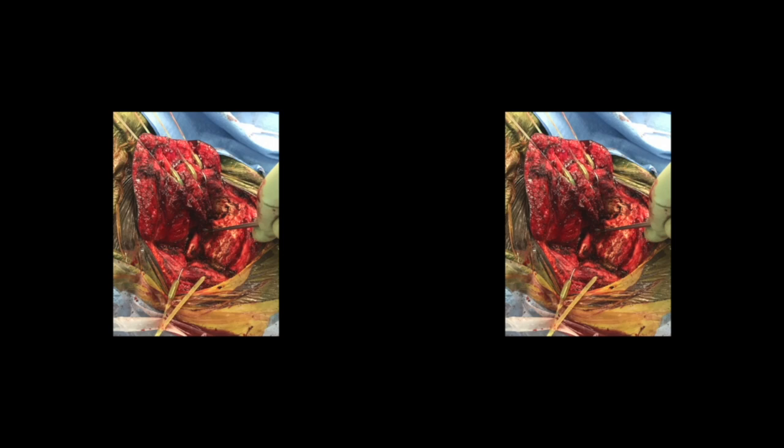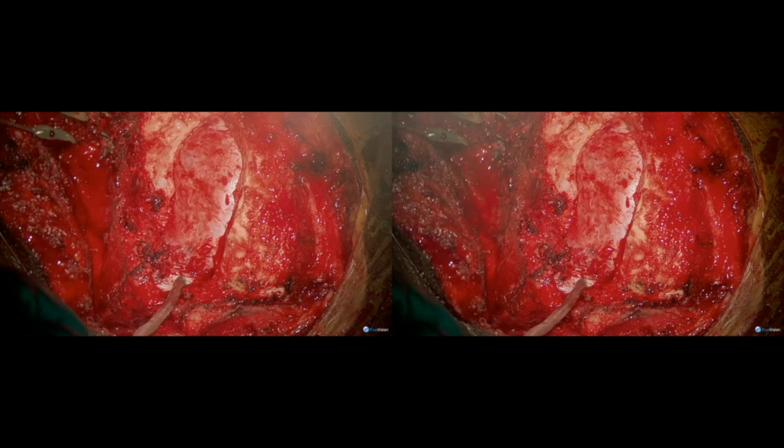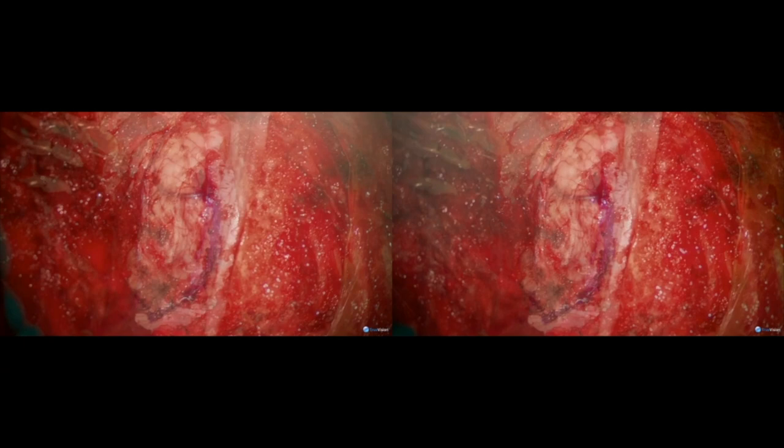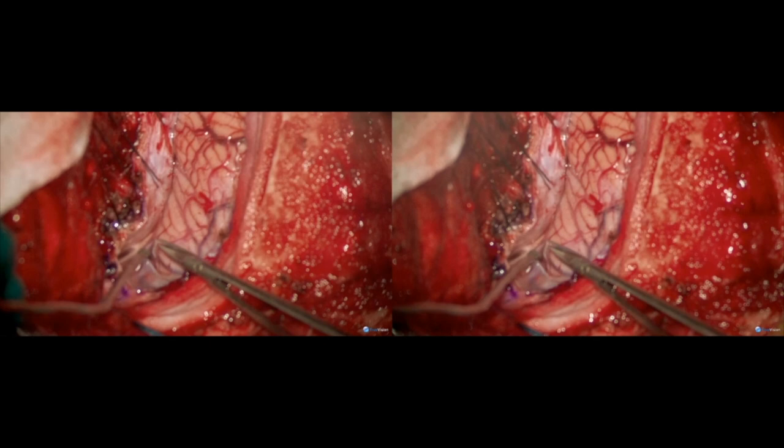A single myocutaneous flap is elevated leaving a cuff at the superior nuchal line for re-approximation, and a suboccipital craniotomy is performed along with a C1 laminectomy. Some of the paracondylar bone is drilled to allow a more ventral angle of attack. The dura is opened in a C-shaped fashion based laterally and CSF is released from the cisterna magna, achieving brain relaxation.